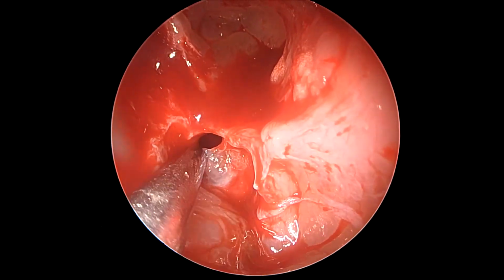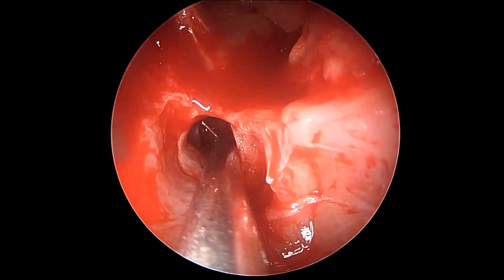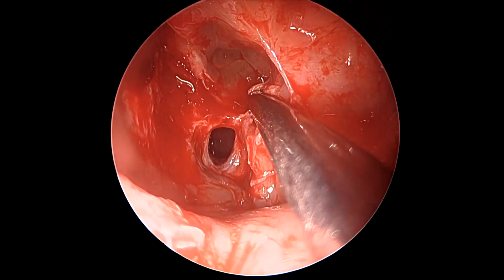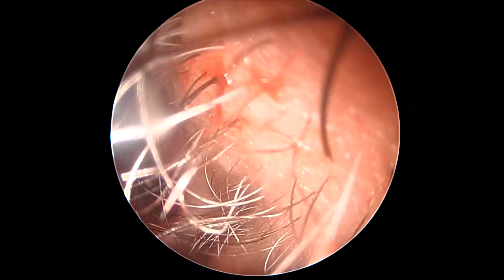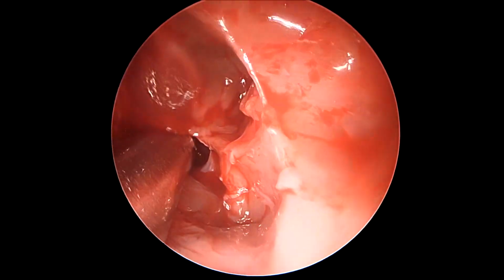As we see here, the sphenoid ostium has already been opened, and that happens to be a very important landmark to identify the lowest most point of skull base. Since it is already open, we can just increase the size of the sphenoid ostium widely so that it does not again cicatrize and lead to any stenosis.